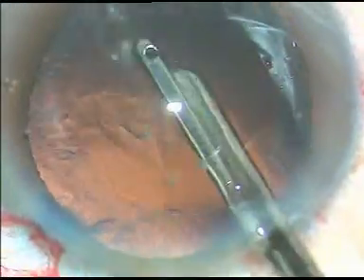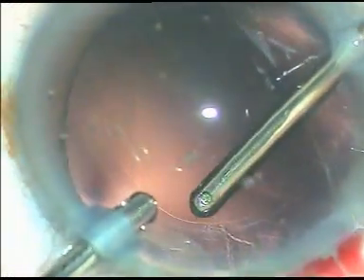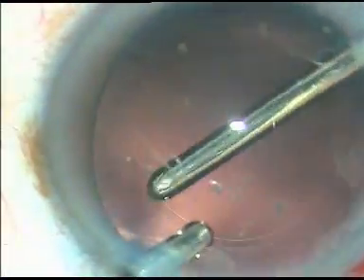Viscoelastic substance is again injected and cortical cleanup is started. A coaxial cannula is used to clean the cortex inferiorly and on both sides. The superior cortex from 11 o'clock to 1 o'clock is being cleaned by a bimanual irrigation-aspiration system.